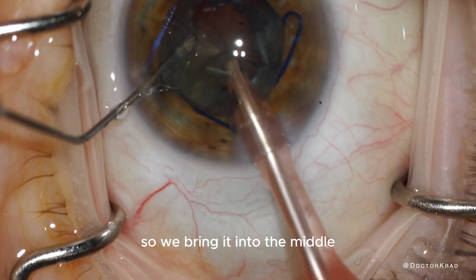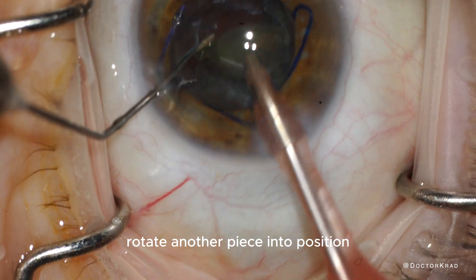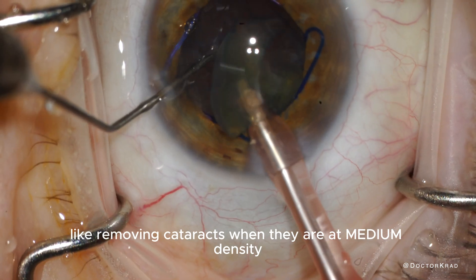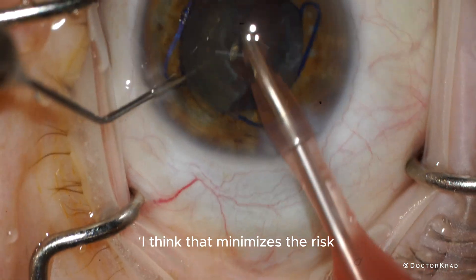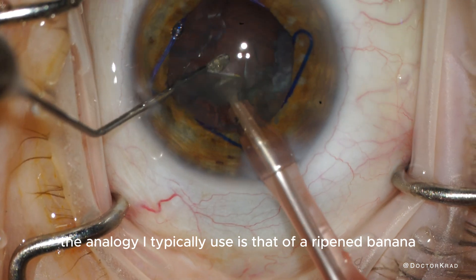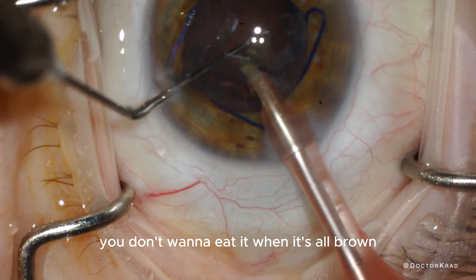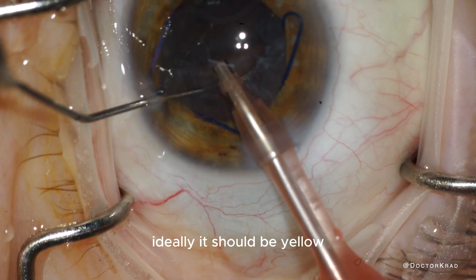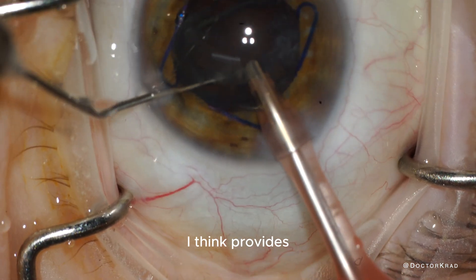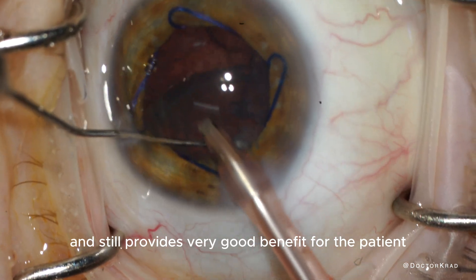Each of the four quadrants will be removed one by one — we bring it into the middle, vacuum it up, and rotate another piece into position. Some cataracts are easier to take out than others. I typically like removing cataracts at medium density, as I think that minimizes risk. The analogy I use is a ripened banana — we don't eat them when they're green or all brown; ideally they should be yellow. A medium cataract provides the least risk for surgery while still giving very good benefit for the patient.